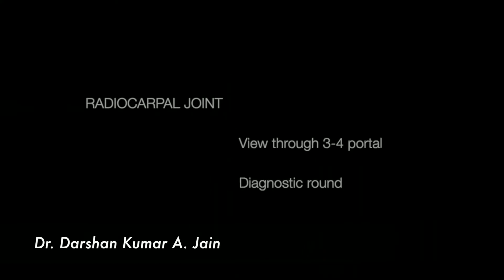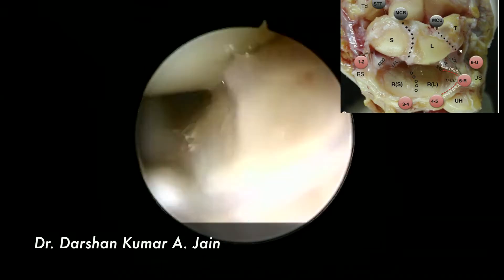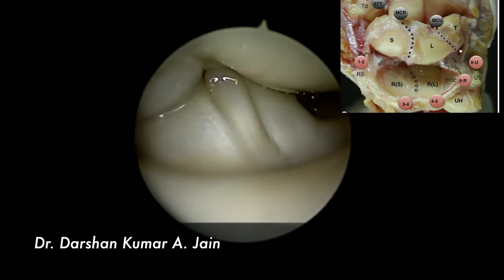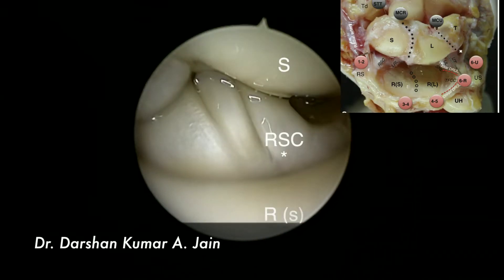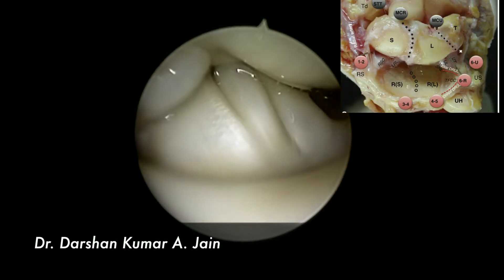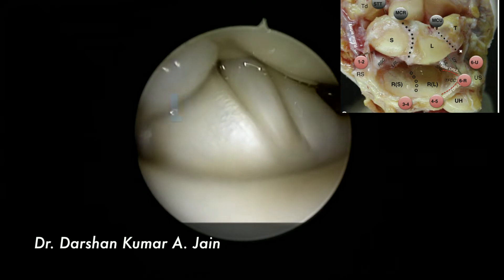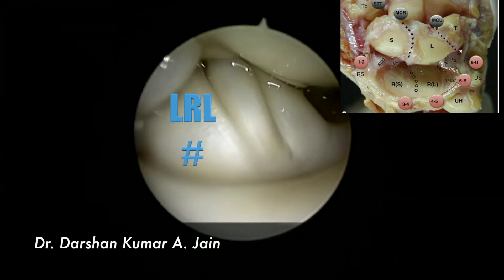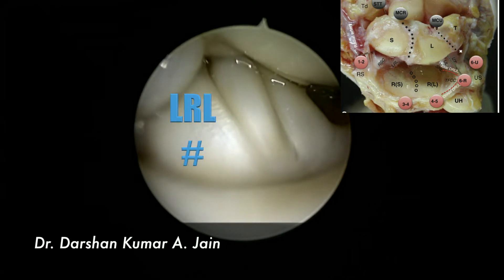Once the scope is inside the radiocarpal joint, first you see the RSC ligament, the scaphoid, and the scaphoid fossa on the radius. Next is the long radiolunate ligament towards the ulnar side.